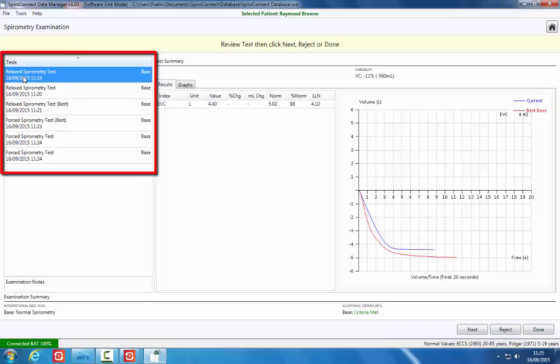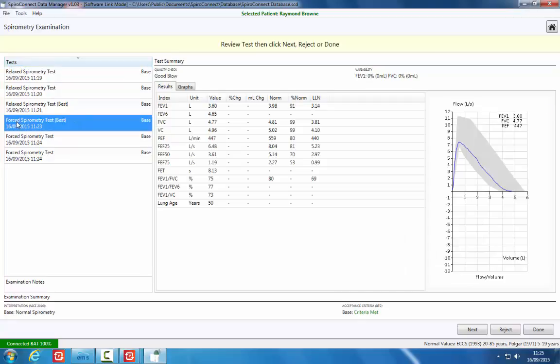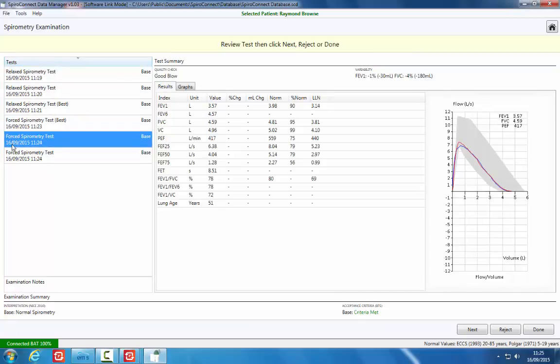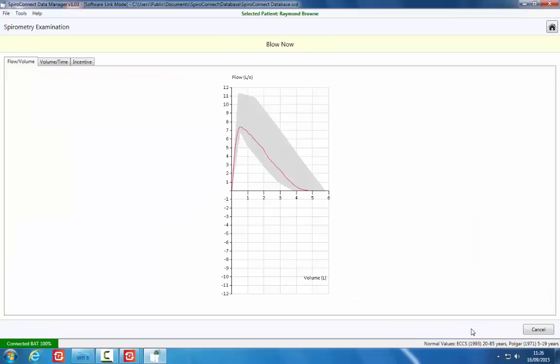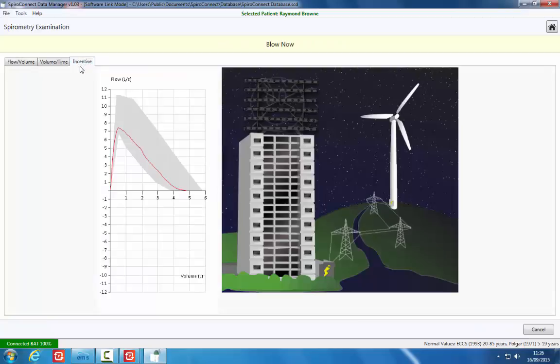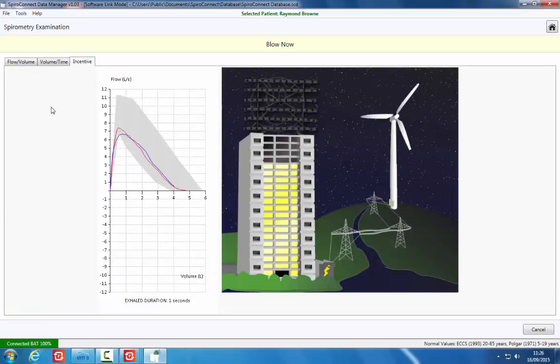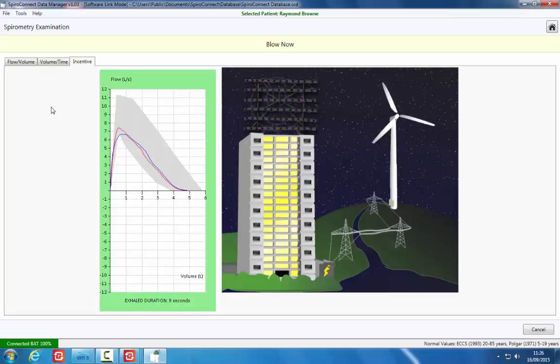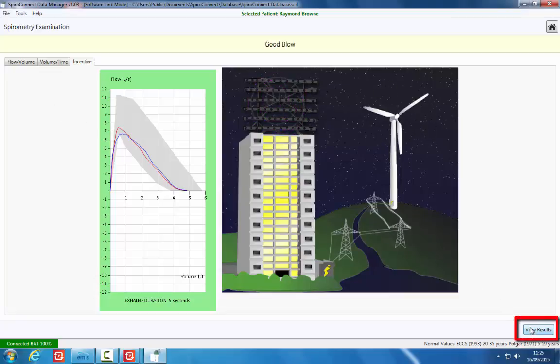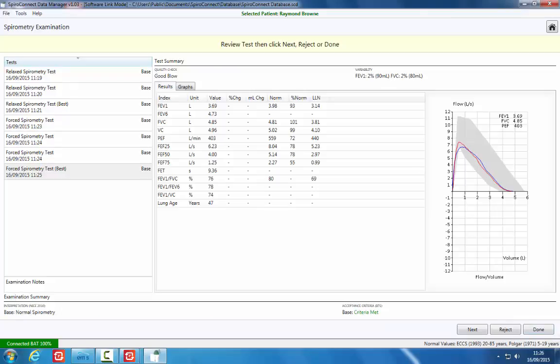Previous tests performed in the current examination can be reviewed by clicking on the specific test results. Also available is an incentive option designed to encourage patients, particularly children, to keep blowing for as long as possible. A flashing smiley face on top of the building at the end of a maneuver indicates that a predefined incentive target set up in the SpiroConnect settings menu has been achieved. At the end of the blow, click the View Results button to see the test summary.